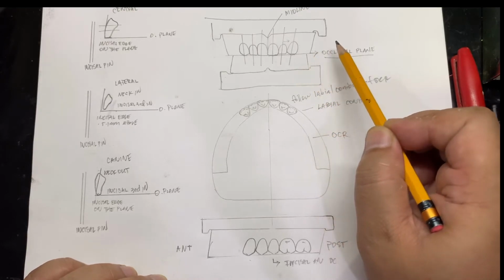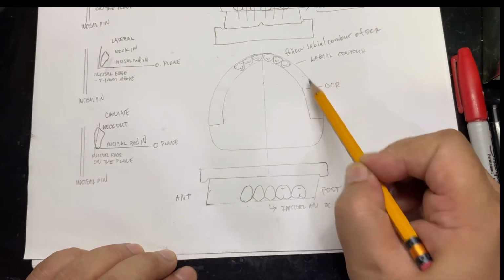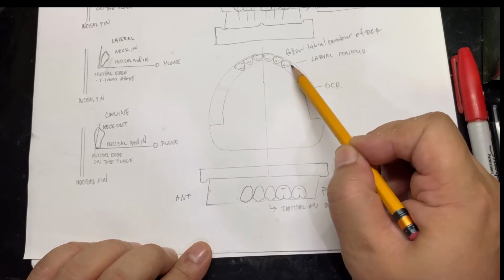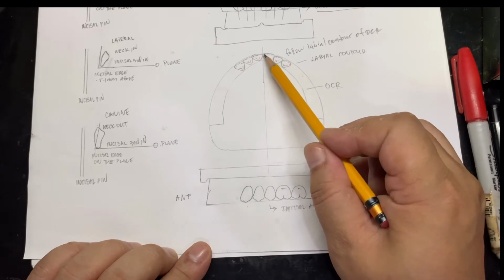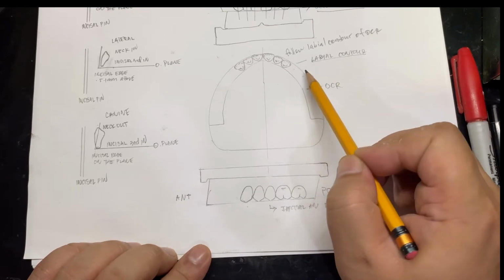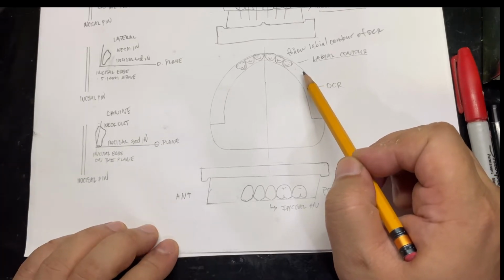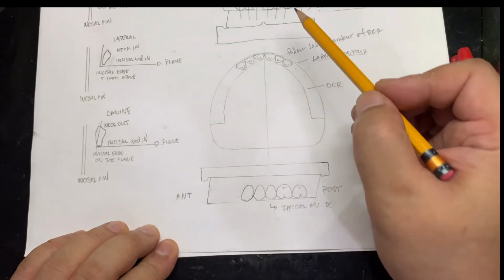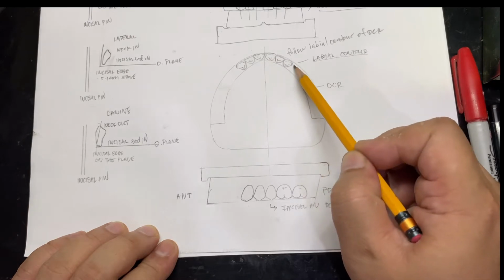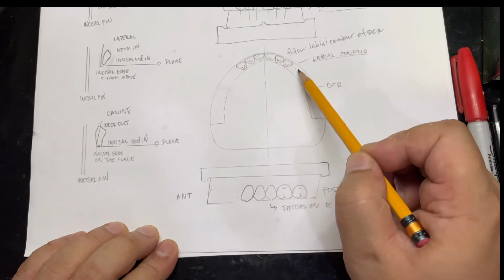And then if you take a look at this one, let's say for example this is your OCR. That's the OCR. You're not supposed to set the central incisor, lateral, or canine labial to the labial contour of the OCR. Take note that this OCR is properly adjusted based on the proper lip support of the patient. So you have to cut a portion of the wax so that you'll be able to embed the denture teeth within the labial contour of the OCR.